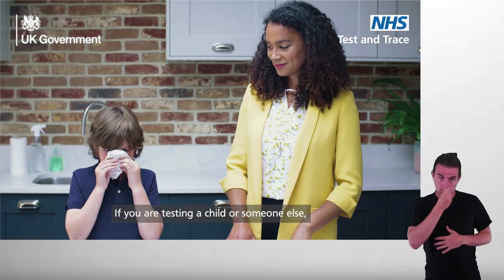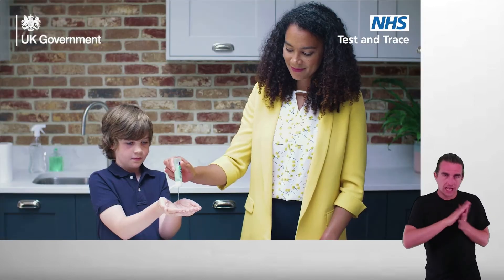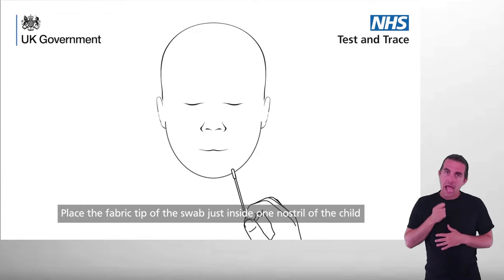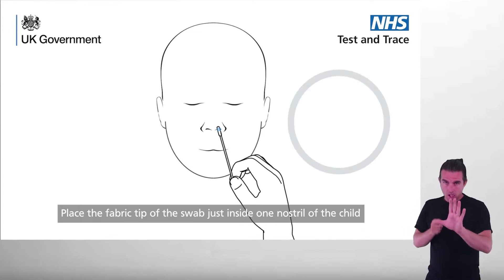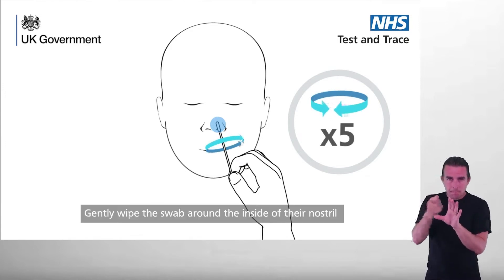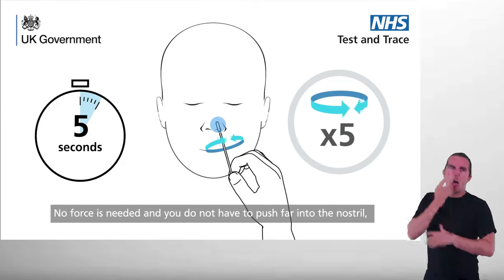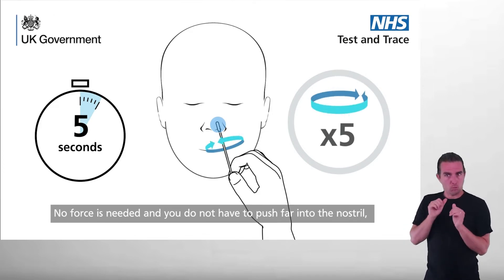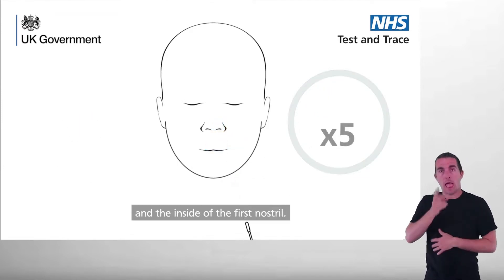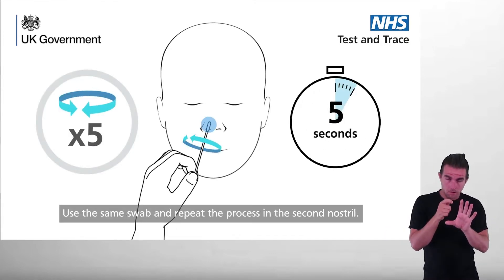If you are testing a child or someone else, help them blow their nose if necessary and ensure you both wash your hands for 20 seconds or use hand sanitizer. First nostril: place the fabric tip of the swab just inside one nostril of the child or the person you are testing. Gently wipe the swab around the inside of their nostril in a circular motion five times for at least five seconds. No force is needed and you do not have to push far into the nostril. Make sure there's good contact between the fabric tip of the swab and the inside of the first nostril. Second nostril: use the same swab and repeat the process in the second nostril.